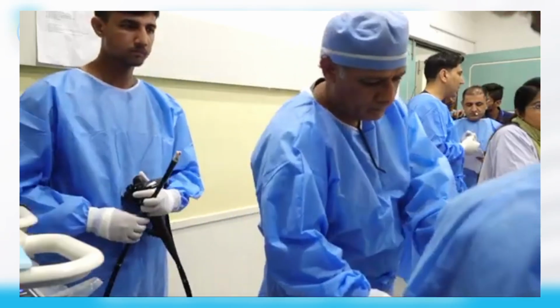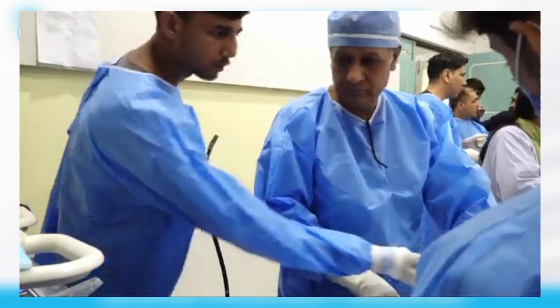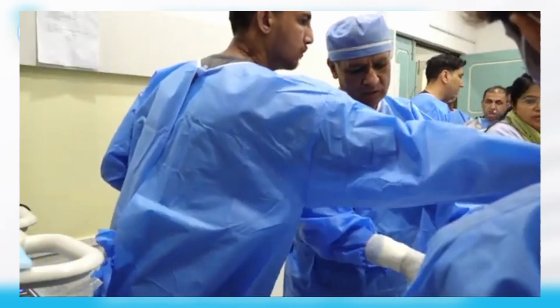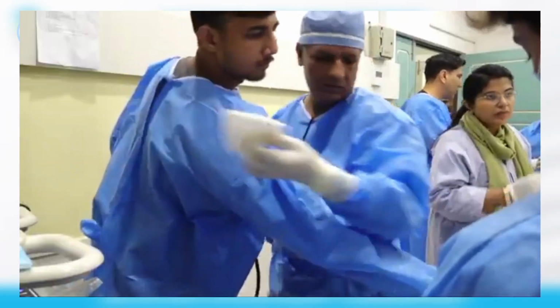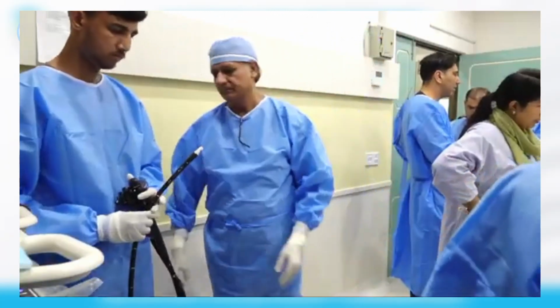There are certain areas where EUS can actually add to the staging of the disease. One of those areas is perihepatic ascites. There may be a small amount of perihepatic ascites which might have been missed on other cross-sectional imaging modalities. So number one, is perihepatic ascites present or not? Number two, are there any focal hepatic lesions in the left lobe?